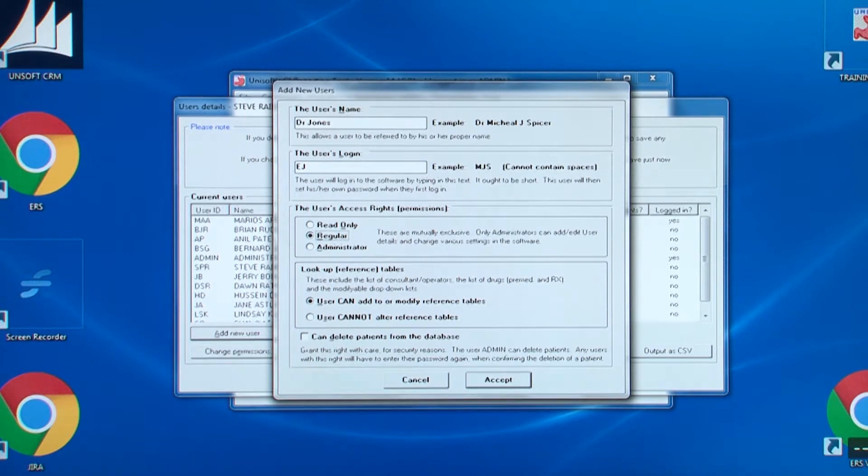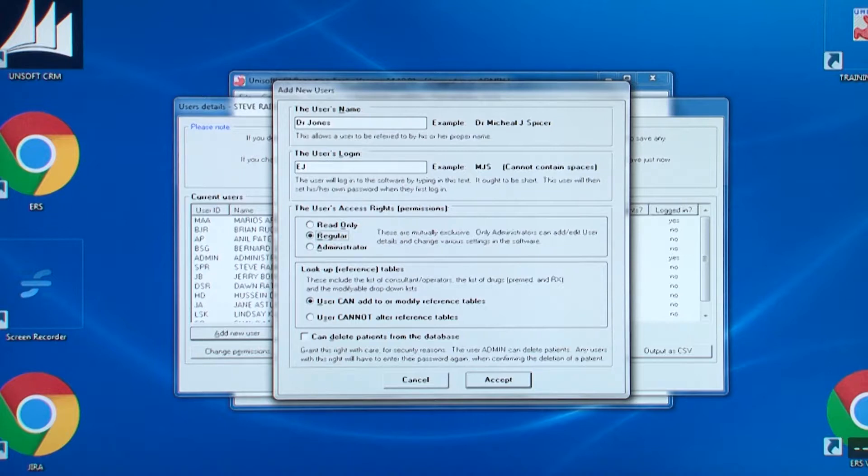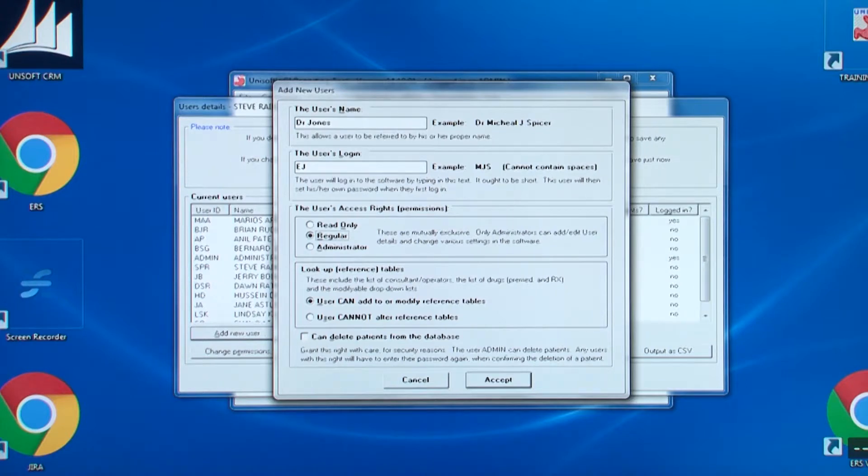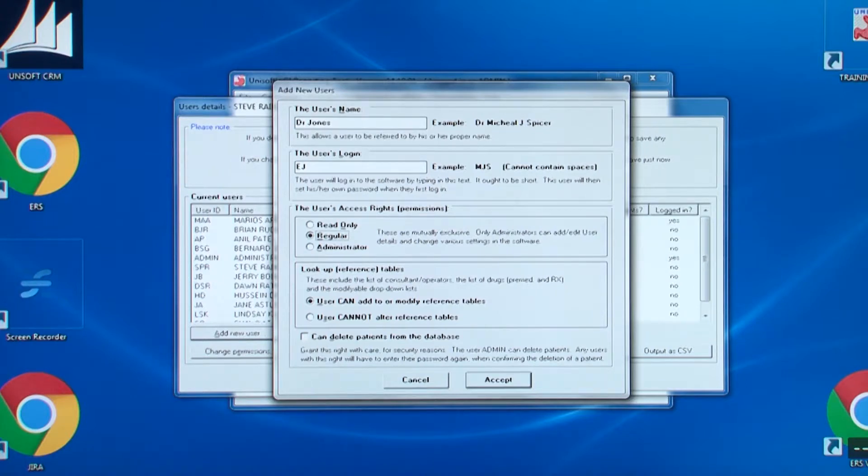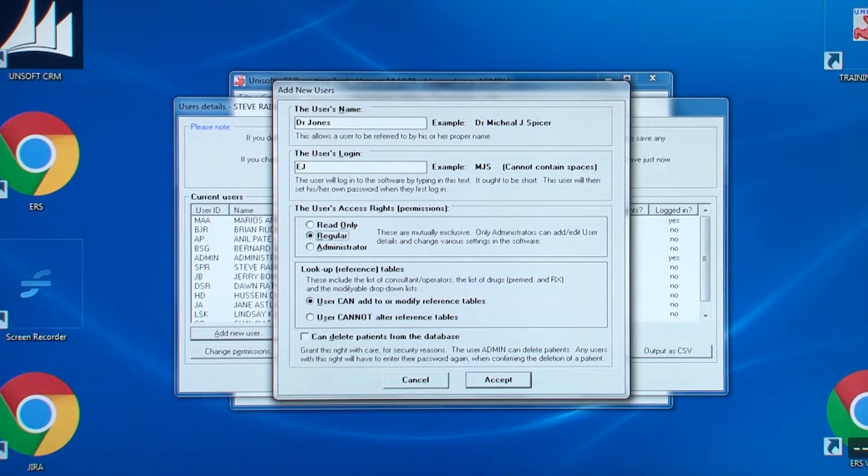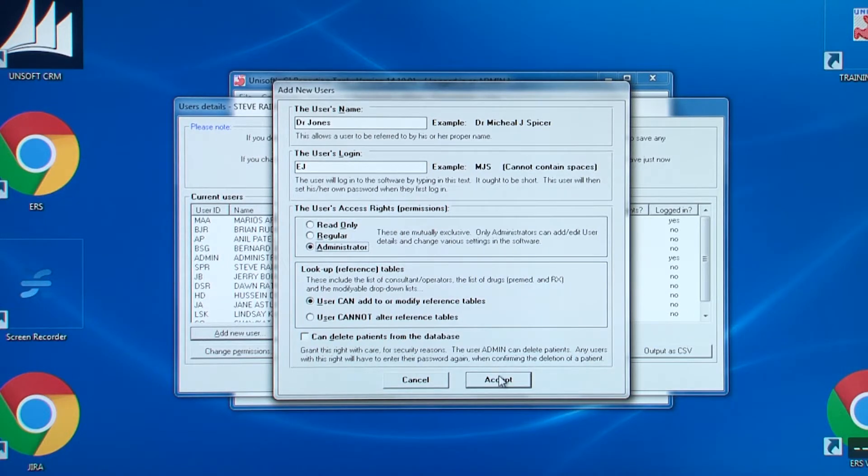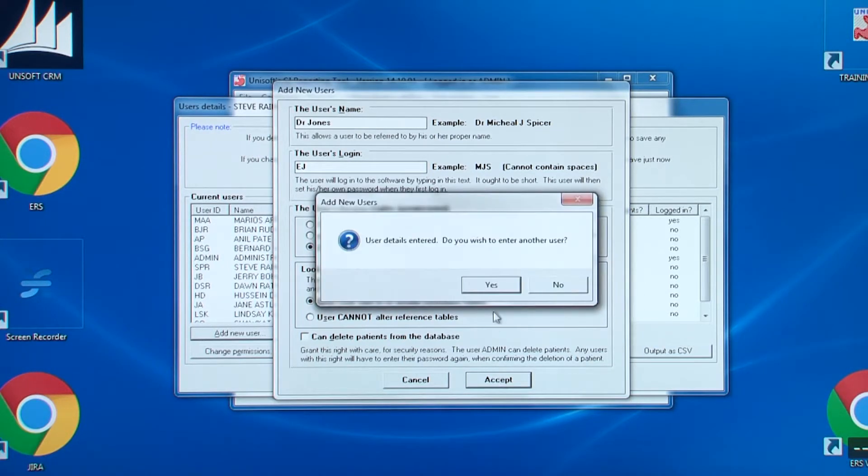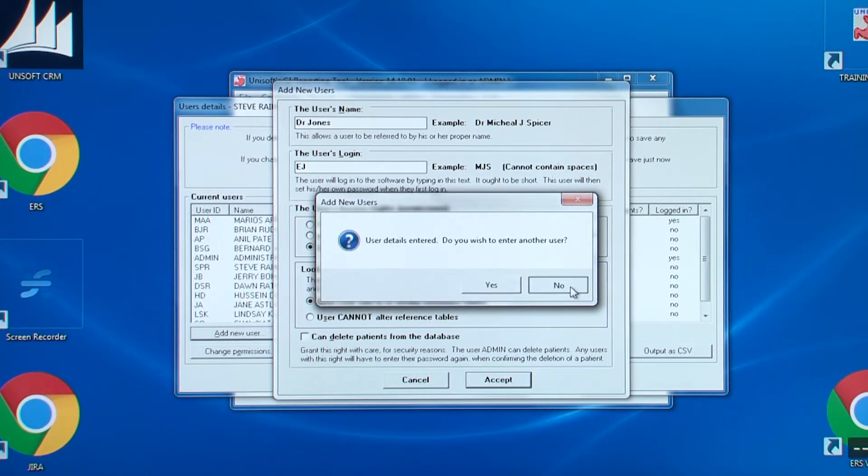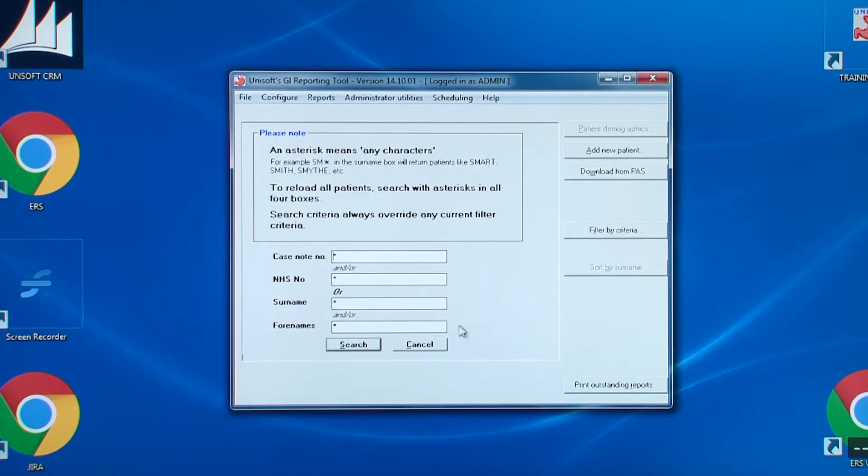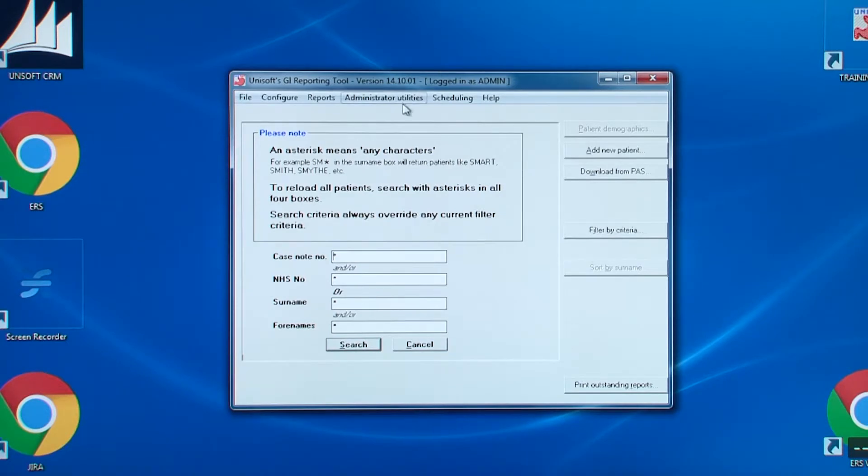The next box allows you to say whether the user can add to or modify the drop down boxes or not. Note that the bottom check box, can delete patients from the database, is greyed out because admin did not log into this software. As already said, only admin can set or change this permission.